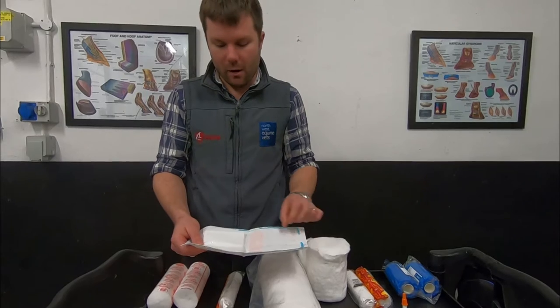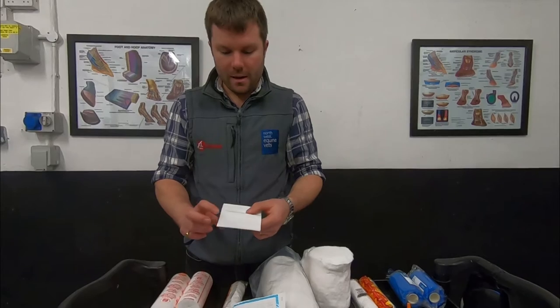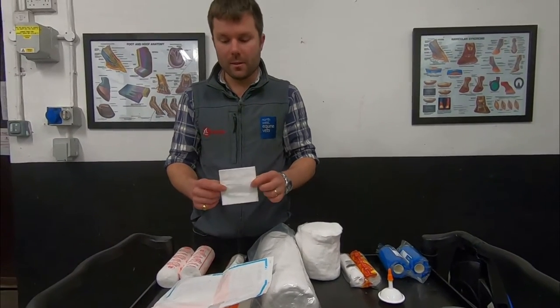With Melalin it's quite easy — there's a shiny plasticky side and a dull cotton wool side, and you want to put the shiny side against the skin. This is the layer that absorbs the fluid and stops it from sticking.